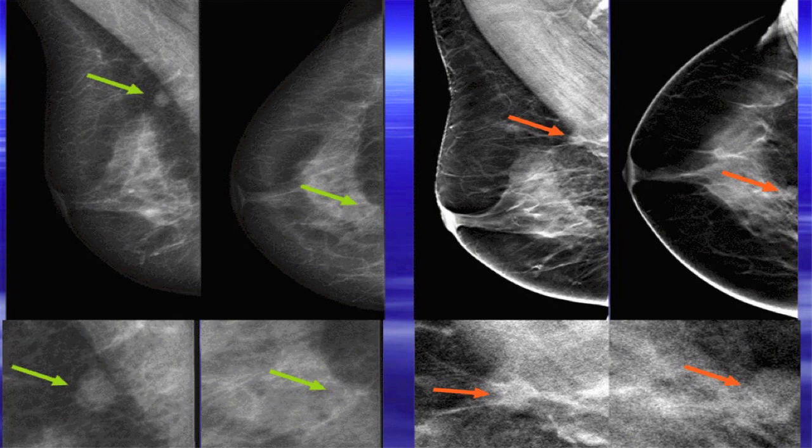And then here, you really don't see anything at all there. And you do the tomosynthesis, and you think, I think there's a little something there. And here it is magnified. This is this one magnified, and this is this one magnified. There's something kind of bulging from the backside. See the bulge from the back that you really don't appreciate here? You get a sense of it. But that's the advantage. So here's the regular mammogram.